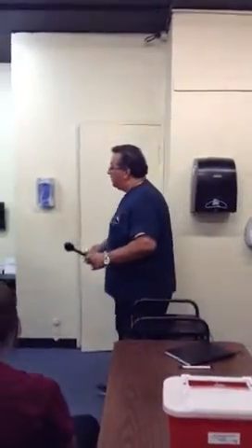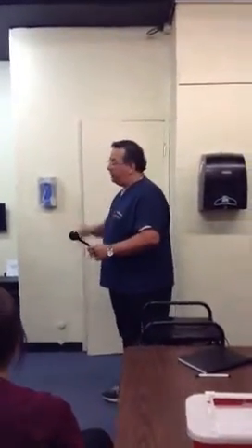I'm going to go ahead and administer the Snellen Eye Chart. Hello, my name is Carlos. I'm the medical assistant here, and the doctor wants me to check your distance visual acuity. We're going to be using the Eye Chart. Is that okay?